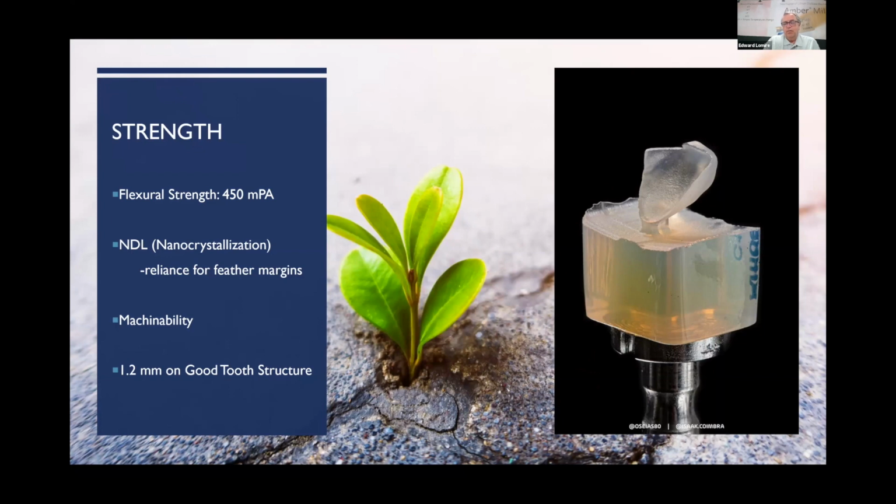Under the microscope, you can see the edges of these, like say on a veneer; you can go down to 0.2 of a millimeter and machine these down. And under the microscope, I'm going to say as close to zero as possible chipping. It's very, very smooth.